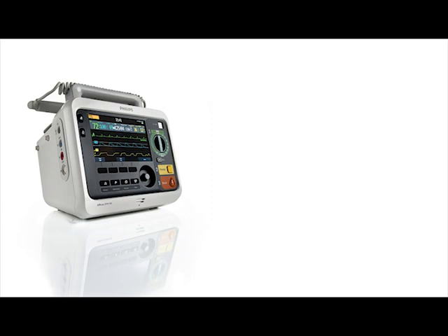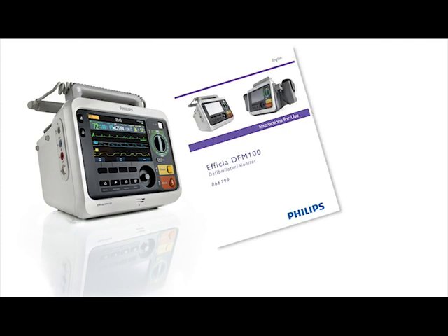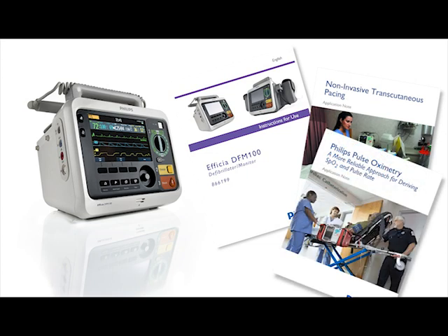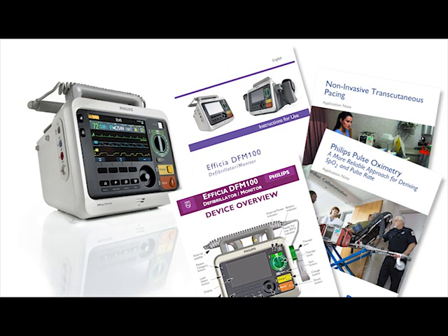Please remember that prior to using the DFM100 and for additional information, you should read the instructions for use and review the other training materials. These materials not only include details about monitoring and defibrillation functionality and operation we covered in this video, but also information about device configuration, care, and troubleshooting, as well as data management.